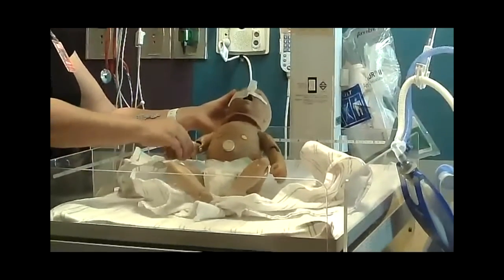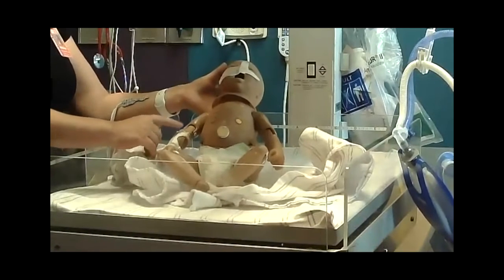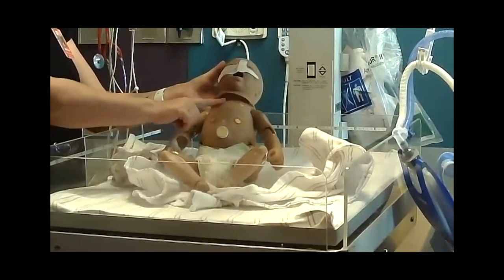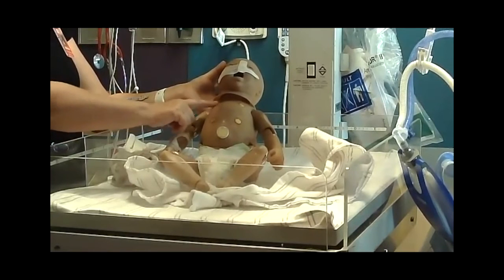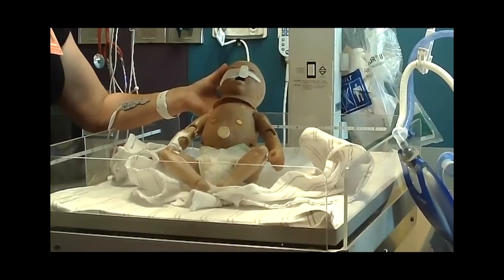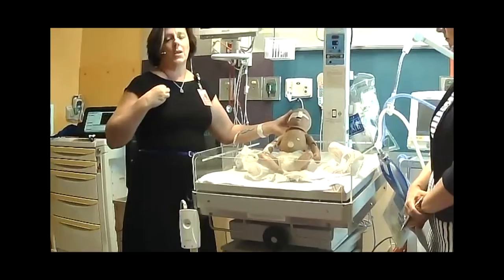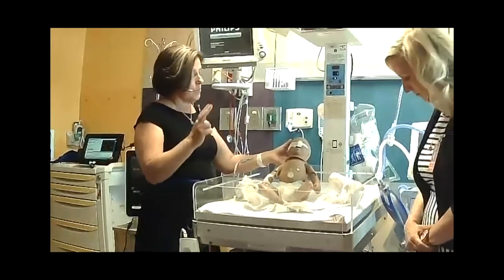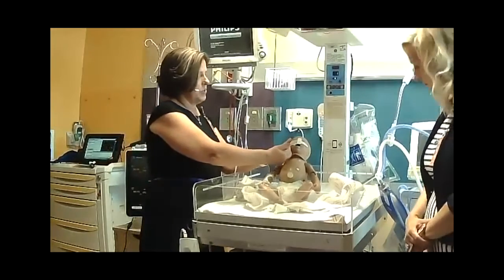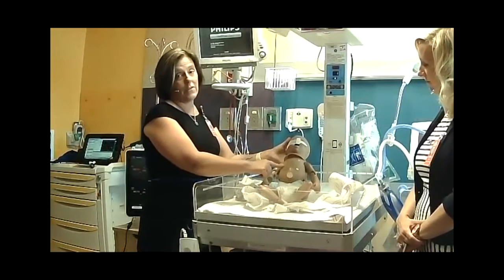So you may have IV lines in the hands, that arterial line, and many times, especially on the smaller babies, you may see an IV that comes out of the chest wall. What that is actually a special IV into the first chamber of the heart, or the right atrium. The right atrium is an area that we can give medicines through. On some of your babies, this is more anatomy, but you have a tube that drains the head that's called the superior vena cava, and the one that drains the bottom called the inferior vena cava.